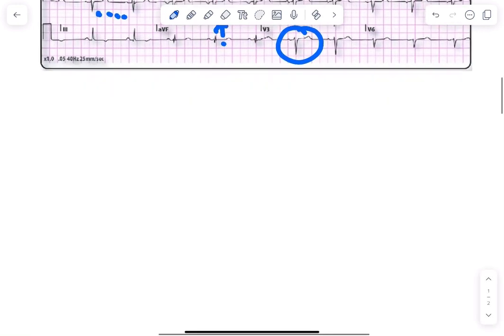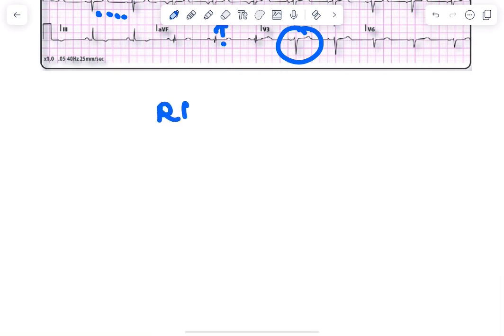All these features together are seen in dextrocardia. So let's recall what are the ECG features of dextrocardia. One is right axis deviation.